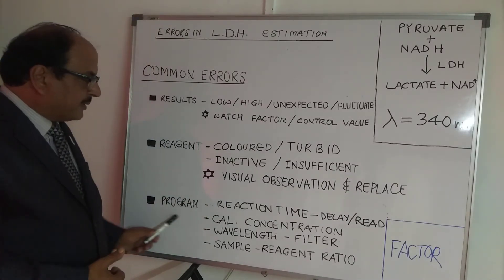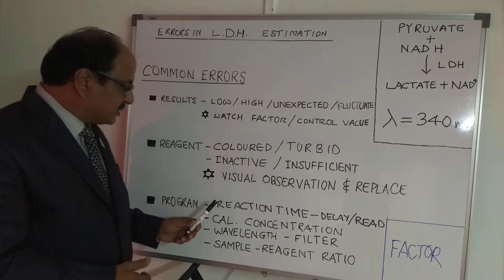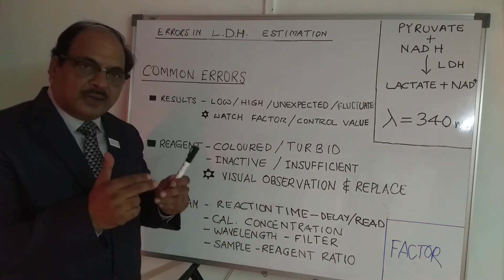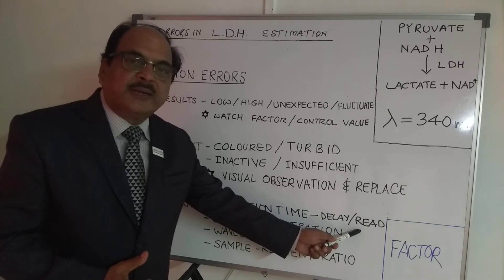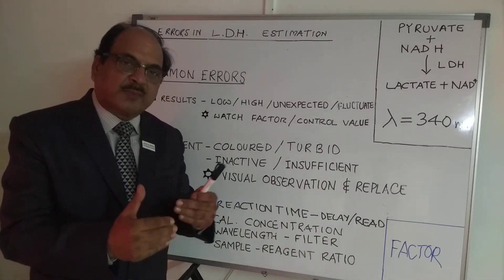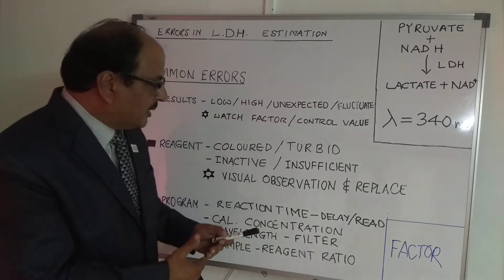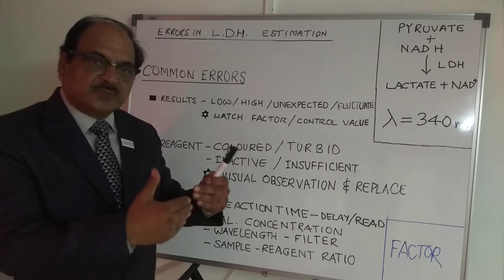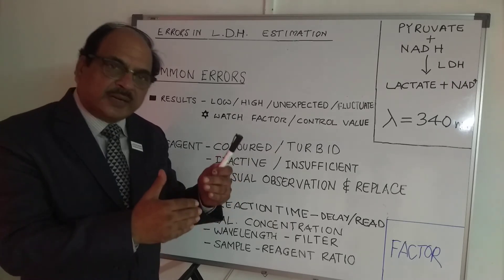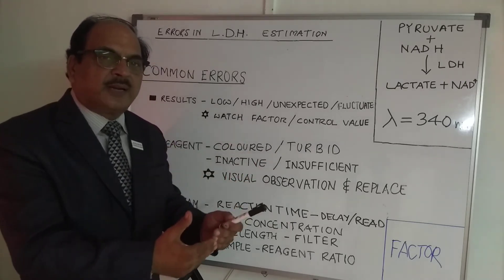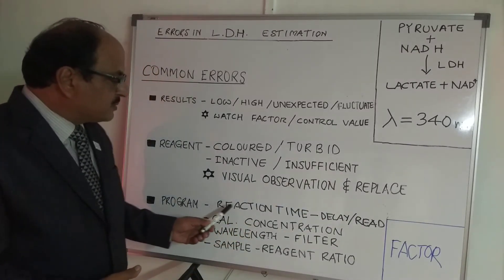The third category is program-related. Since this is kinetic chemistry, the reaction time is controlled by the program's delay time and read time. These figures are mentioned in the user manual or technical insert. If the recommended delay time is 60 seconds, ensure that it is followed. The instrument calculates delta OD per minute, so the recommended delay time must be strictly maintained.